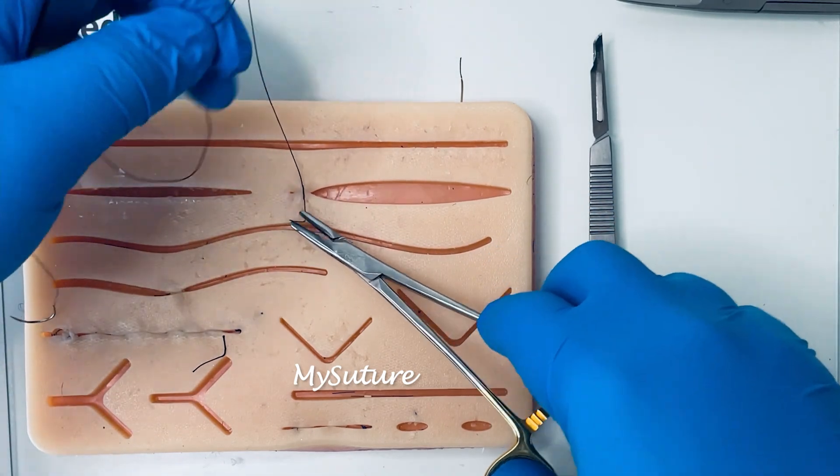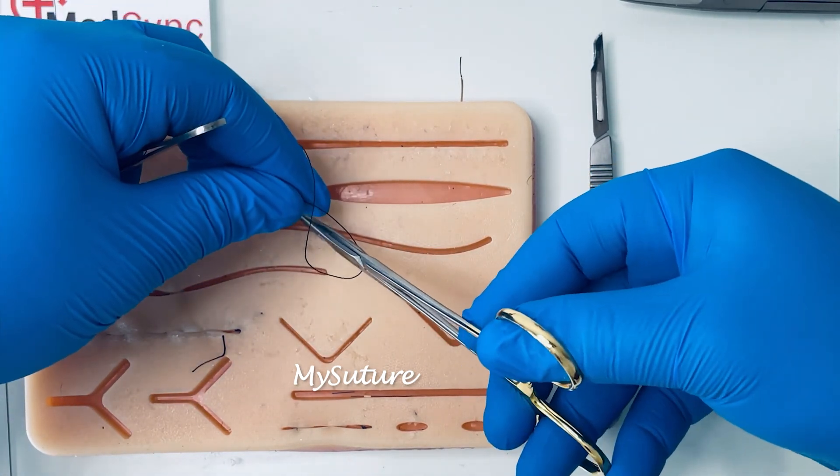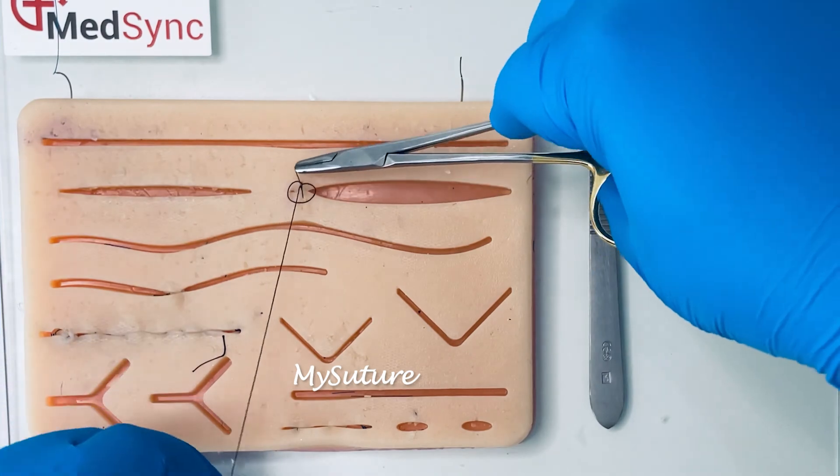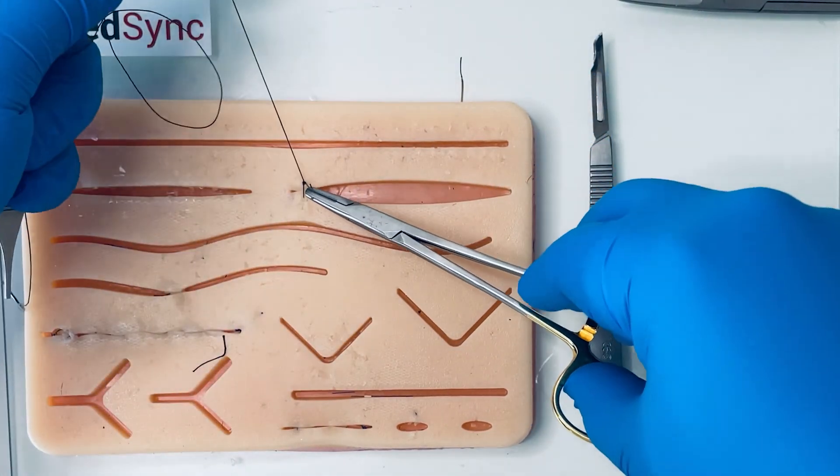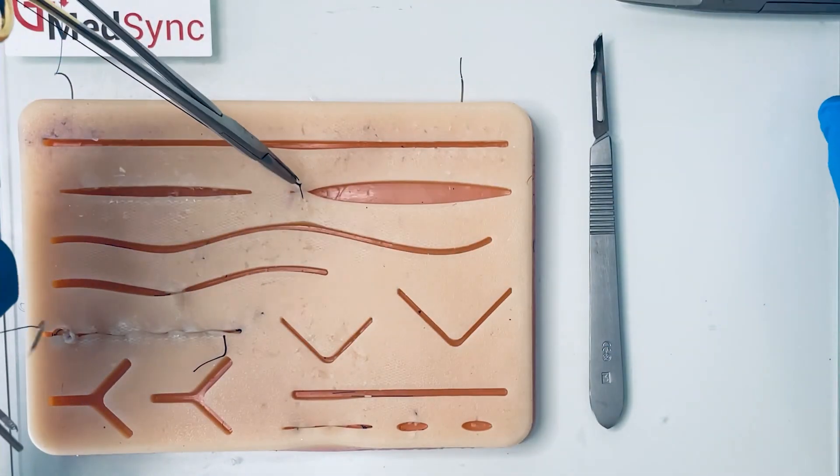The first technique is to select a non-dissolvable suture in order to control wound closure over the time it takes for the wound to heal. Removal of sutures is delayed over the most tense parts of the wound.